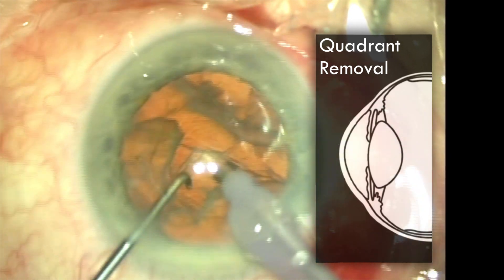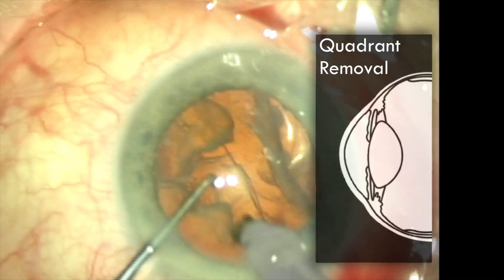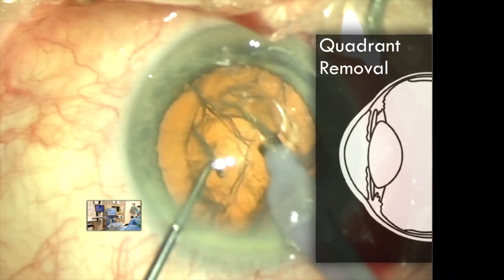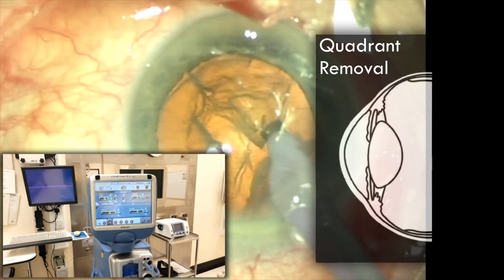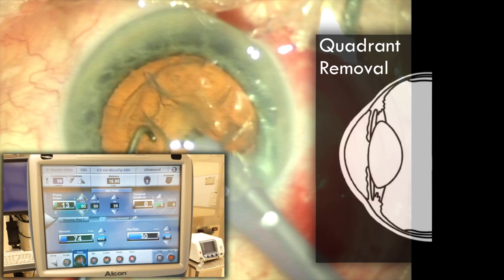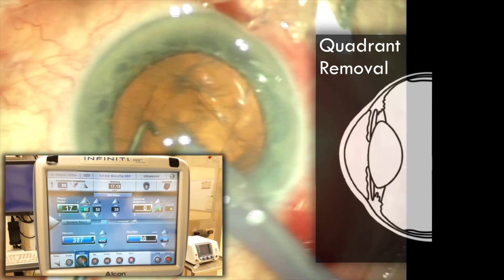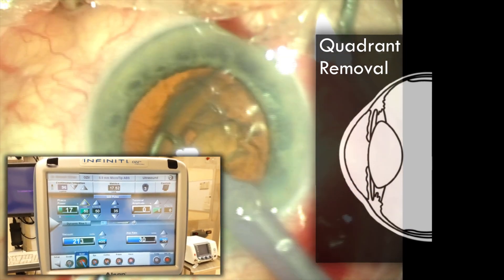The pedal control on the phaco probe is like a car accelerator pedal. I'm listening out for the sounds that the phacoemulsification machine is making — like an engine — such as if the probe is occluded or how much vacuum I'm using. You can also see these changes visually on the screen.